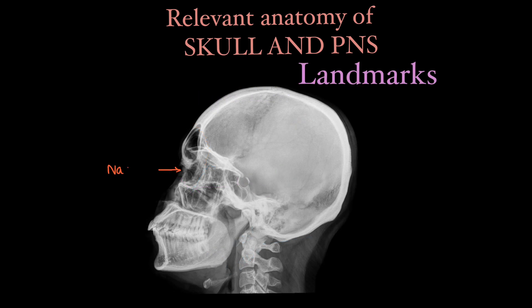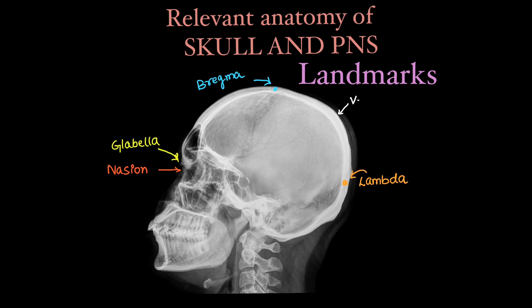We will look at some landmarks helpful in taking the x-rays. At the base of the nasal bone there is nasion. The forward most point on the forehead is the glabella. The point where both coronal sutures meet the sagittal suture is the bregma. The point where both lambdoid sutures meet the sagittal suture is the lambda.